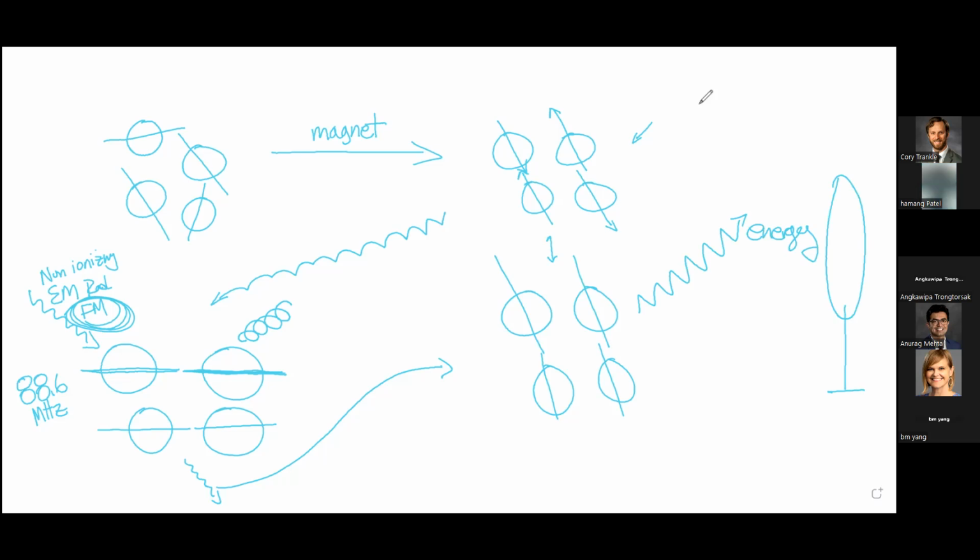So you'll hear these sounds when you're in the middle of scanning. And those sounds relate to a couple things, not so much all of the transmissions that I'm showing you here, but they relate to some of the magnetic field changes that occur that coincide with some of this FM radio wave transmission.